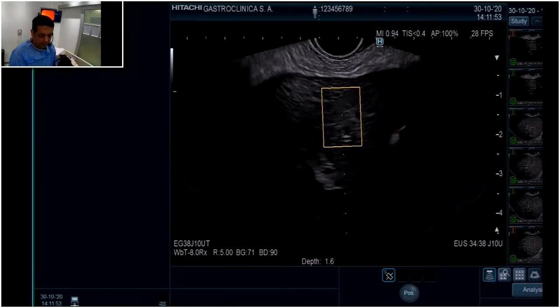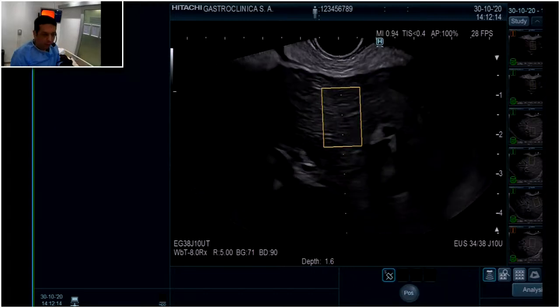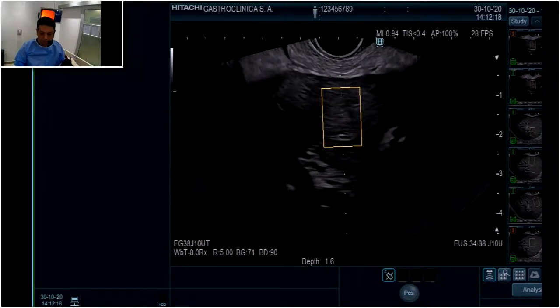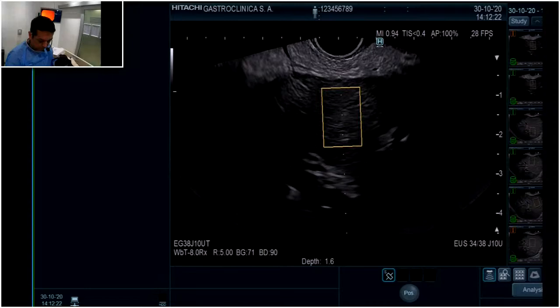So I know that this patient has segments of the liver that are very hard. The mean is more than 20, and probably the prognosis of this patient in the future is bad because the development of hepatocarcinoma is higher than 30 to 40%, as described before, not in the US but just with Shear-Wave technology. Okay.